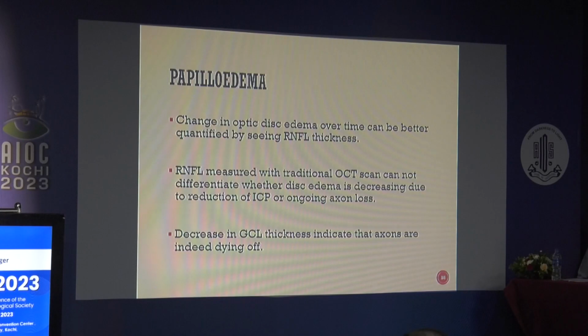Now coming to papilledema, definitely a very good application of OCT. Change in optic disc edema over time can be better quantified. Many times we have to objectively see whether these values are getting lowered or not. Sometimes you have to explain it in a better way to the neurophysician, the neurology specialist, because subjectively different people can have different perspectives, so values should be there.